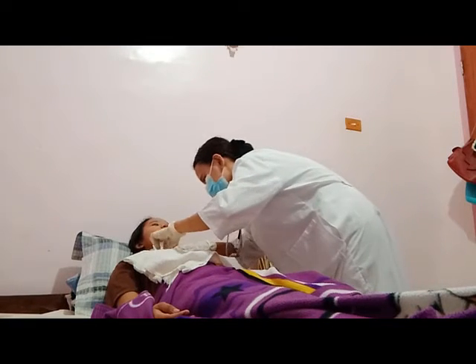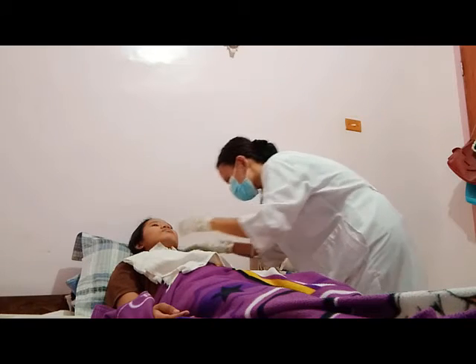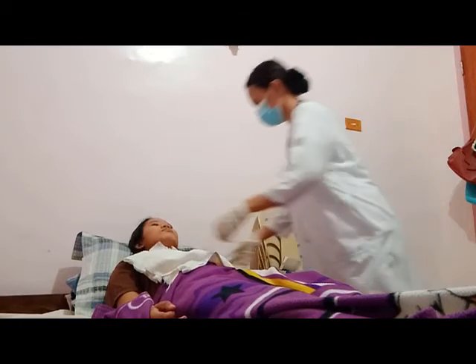Check the fit of the tracheostomy collar. You should be able to fit one finger between the neck and the collar. Check to make sure that the patient can flex the neck comfortably. Apply the oxygen source if necessary.